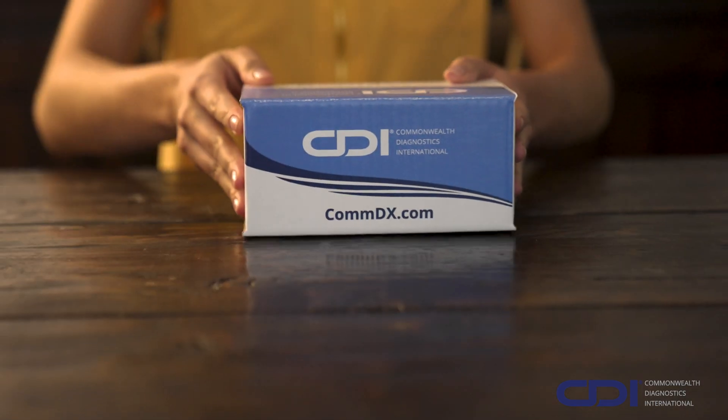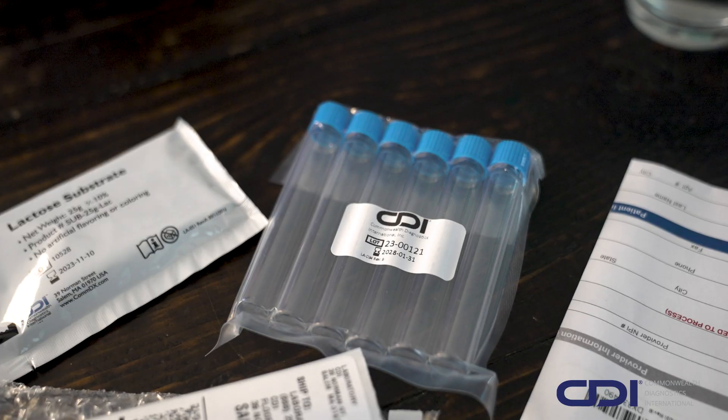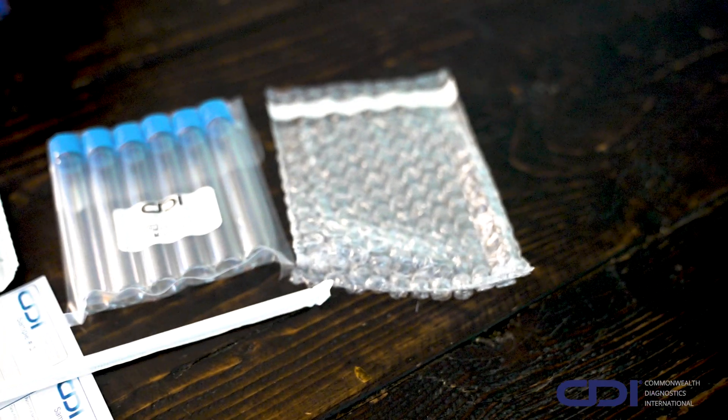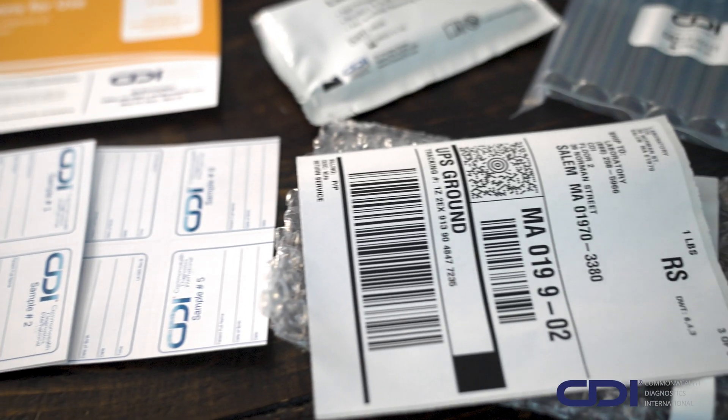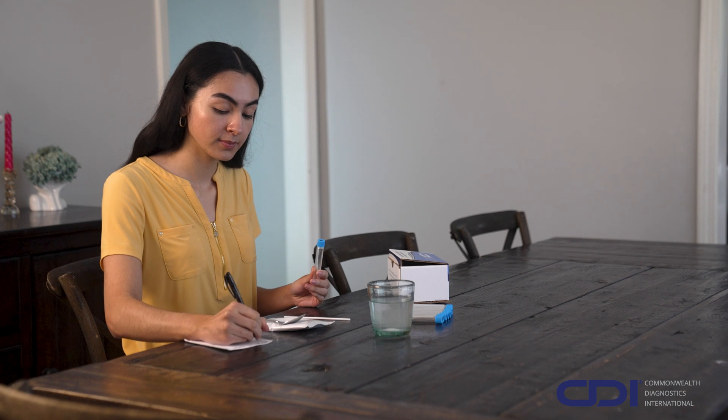Before testing, let's review the contents of your test kit. Your kit includes a straw, substrate packet, six breath test tubes with labels, a bubble wrap packet, a prepaid shipping label, and a requisition form. Be sure to fill out and include the requisition form and other required information when you return your kit.